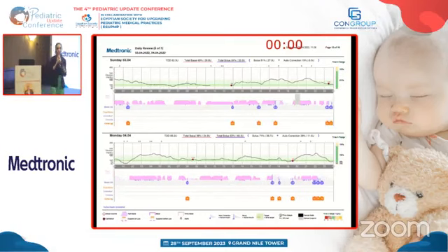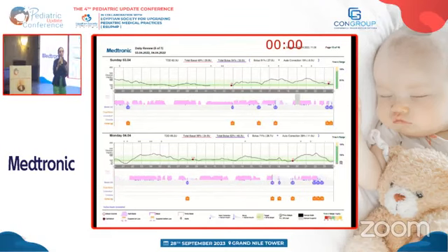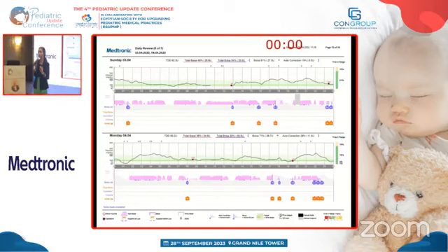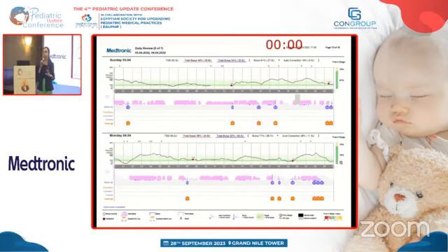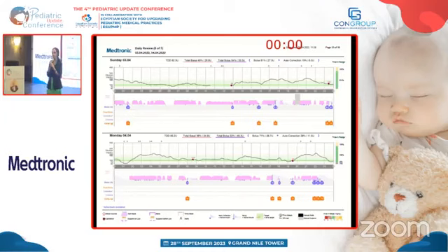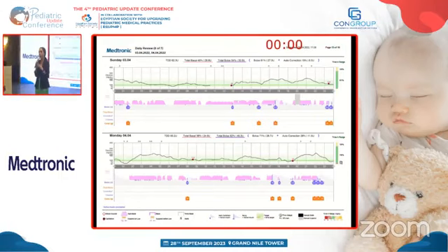فهي دي فايدة ان انا الكيسز بتاعتي ان انا بس مش ببص على الارقام الاساسية الكبيرة اللي في الاول واقول عليه well controlled. دلوقتي عشان اقول well controlled انا محتاجة الcomplete picture بتاعت البيشنت بتاعتي هتكتمل لما اشوف الارقام الاساسية. بعد كده ابص day by day ده هيخليني اخد الديزاشن الكلينيكال المظبوط عشان اوصل بالبيشنت بتاعي للتايت كنترول. وهو ده التارجت من التكنولوجي كلها ان انا بس مش عشان انا احقق كنترول انا اوصل ازاي بماي بيشنت تو ذا تايت كنترول مع كواليتي اوف لايف.